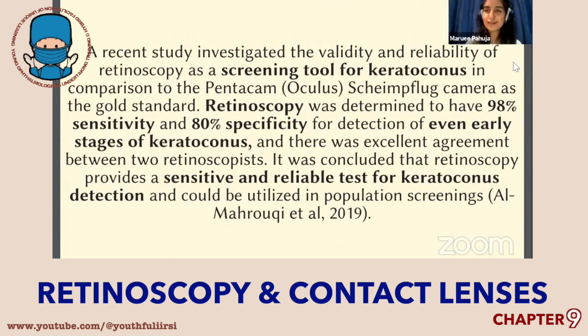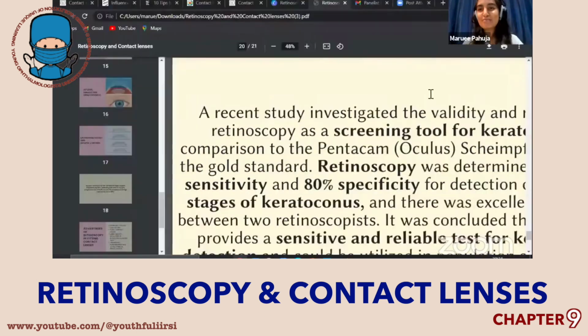So a 15 to 20,000 rupee device is as good for screening, mind you, only for screening, as compared to a 35 lakh device. So let's get our hands on learning retinoscopes and getting a little more practice into it, so that we can be less heavy on our pockets as well.